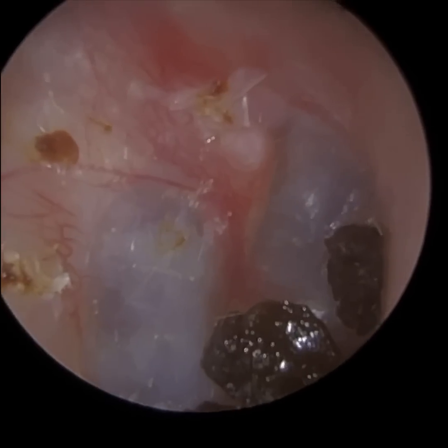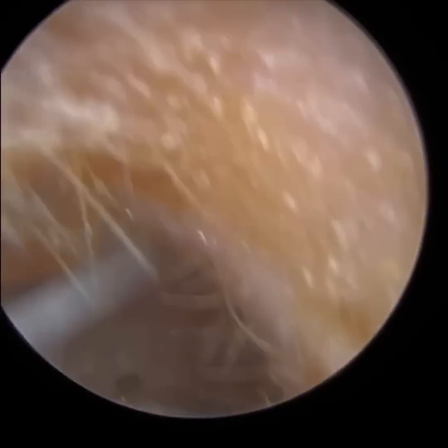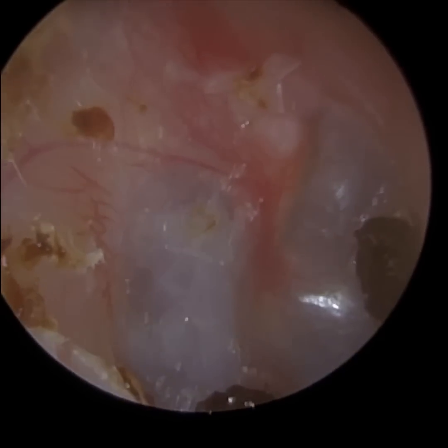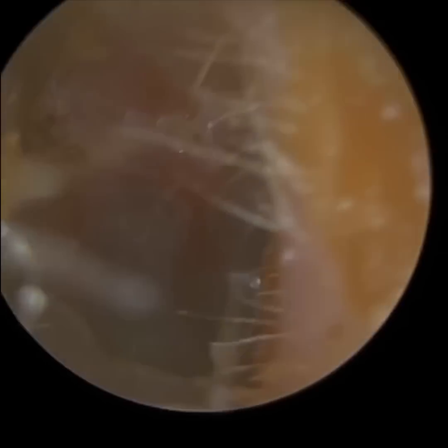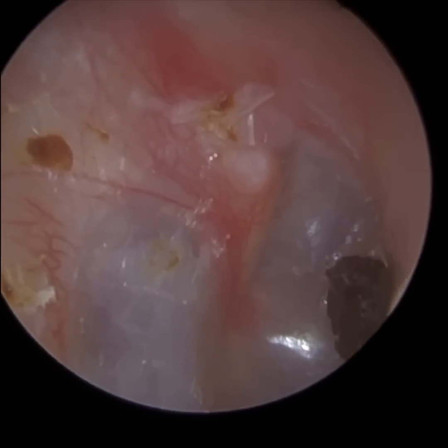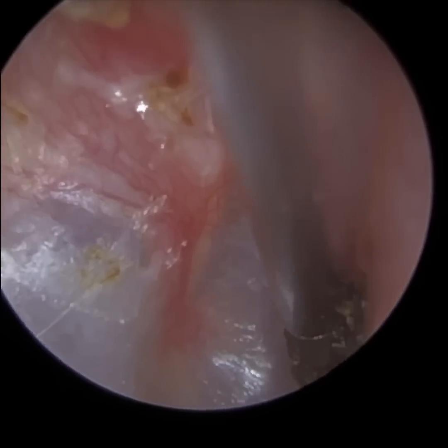So you can see those almost pellets of wax and coating. They're very dry. So the first one came away pretty easily. And then there's one or two even in the anterior recess. So the anterior recess is the region to the right-hand side. This is the patient's right ear. So the anterior recess is on the right-hand side, and vice versa if it was the left ear. So the anterior recess is a little alcove, or recess, hence the name, created by the ear canal narrowing as it approaches the eardrum and widening back out.